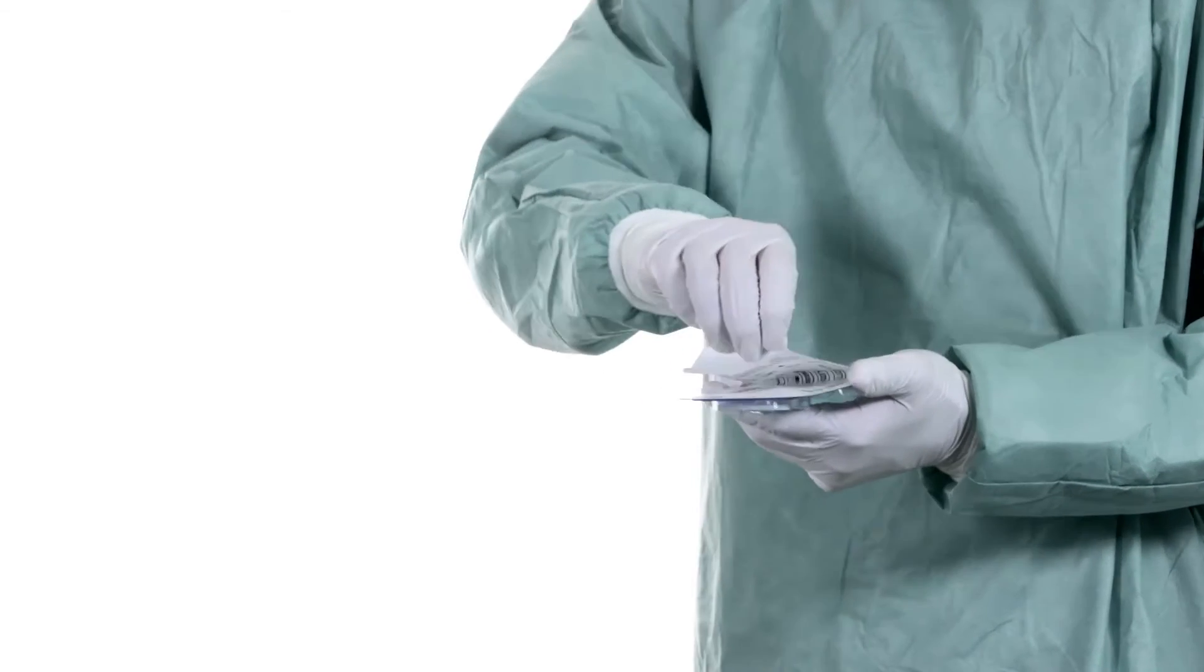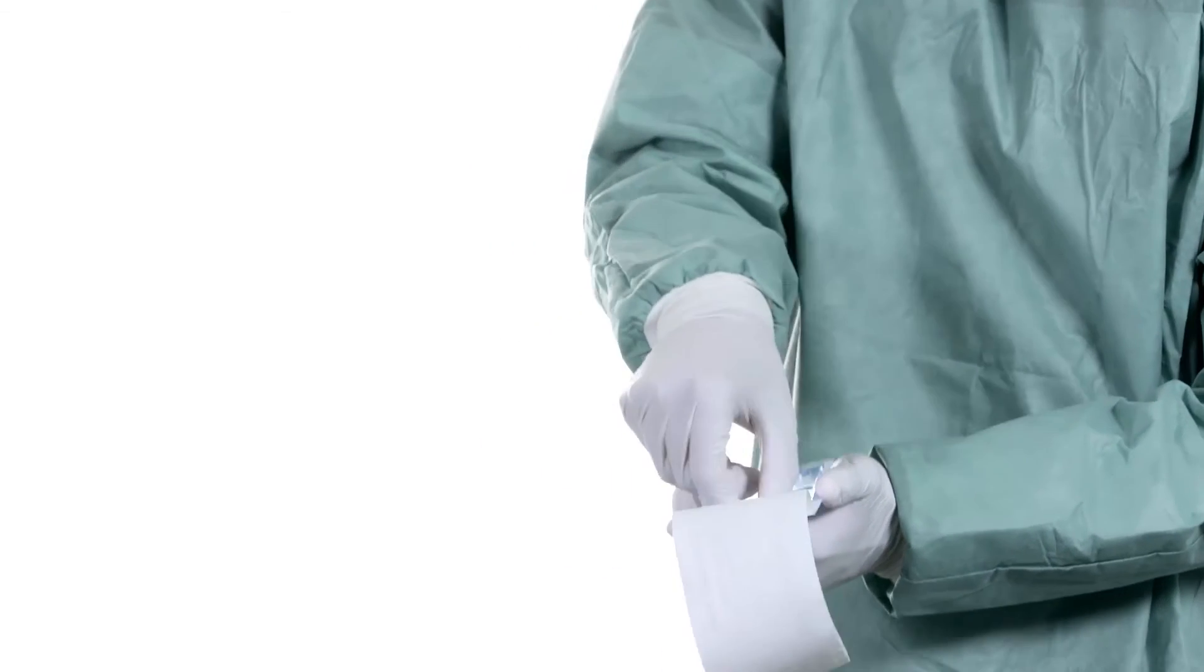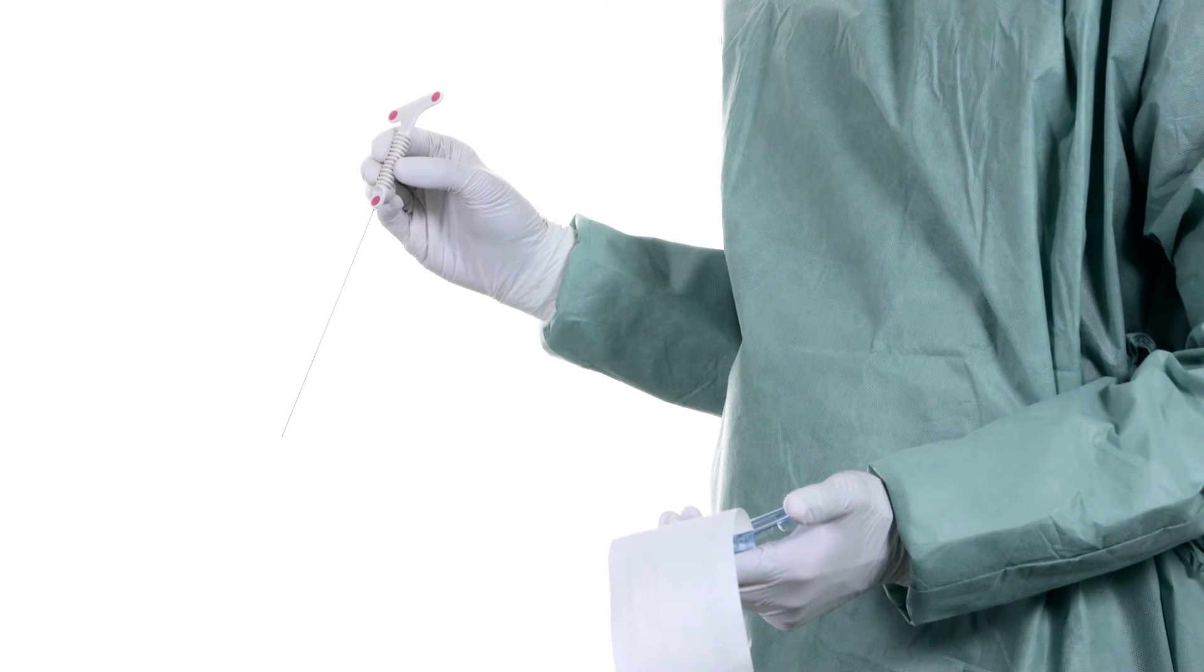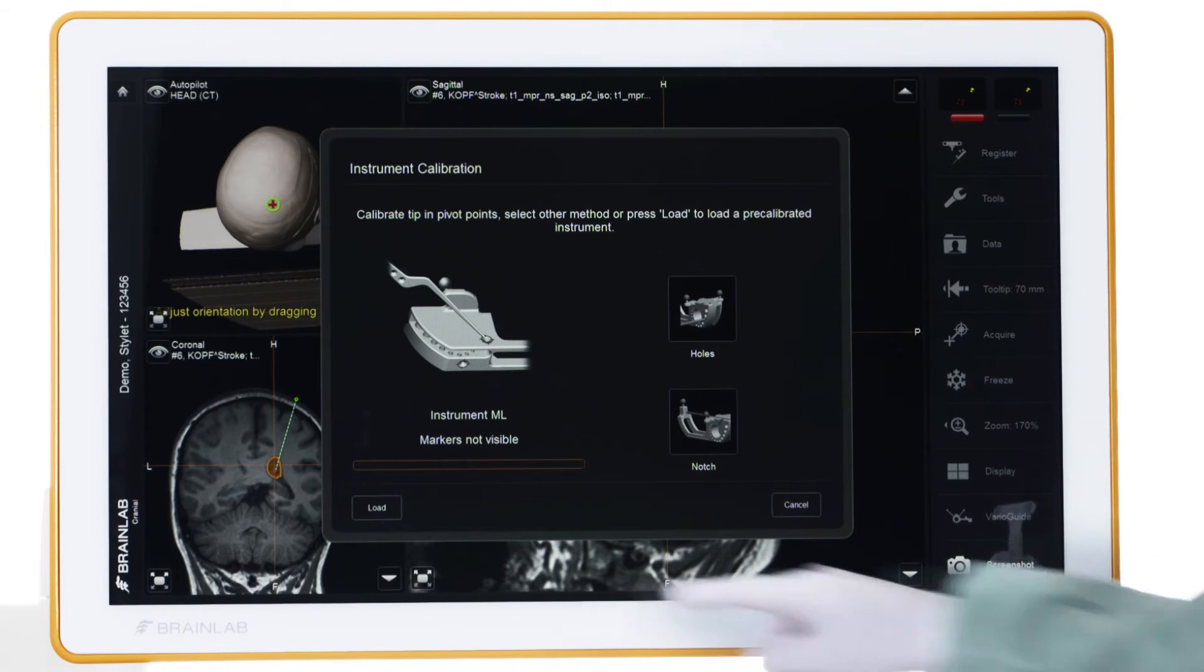Once patient registration is complete, the incorporated passive marker geometry of the pre-calibrated disposable stylet is automatically recognized by the BrainLab navigation camera.